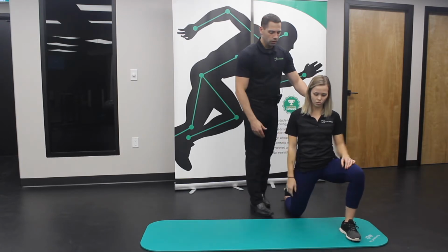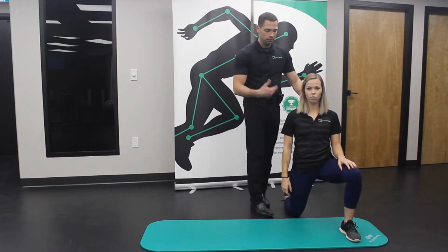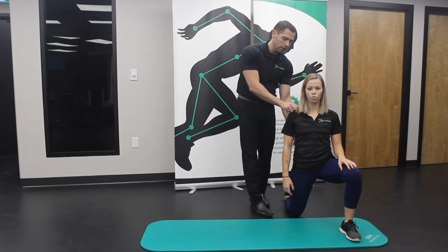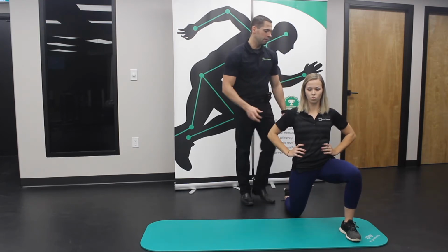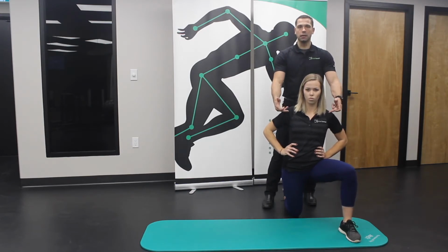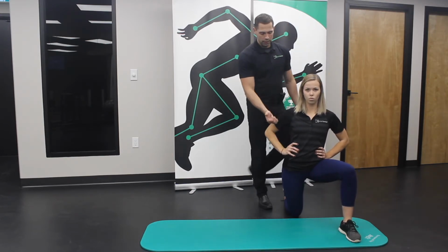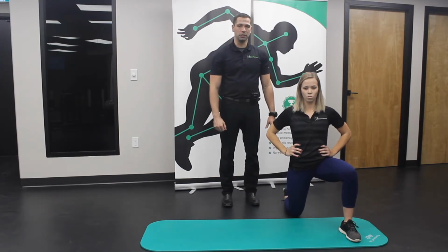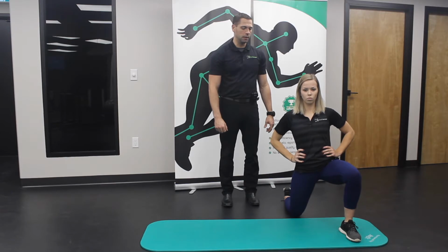We do the same thing from the other direction as well. Maggie puts the hand on the left hip, and we press over, trying to maintain shoulders square, and at least get it 3 inches to either side. You can see that she's a little bit tight in this position.